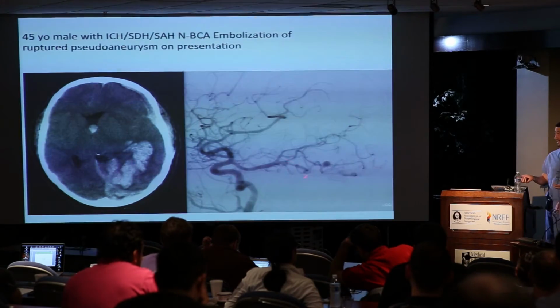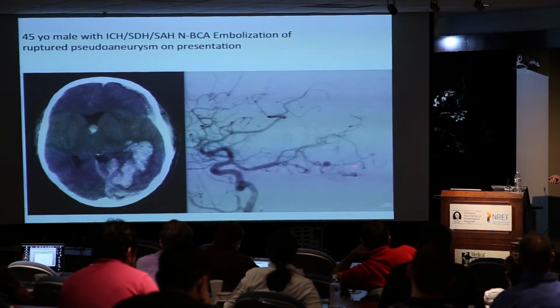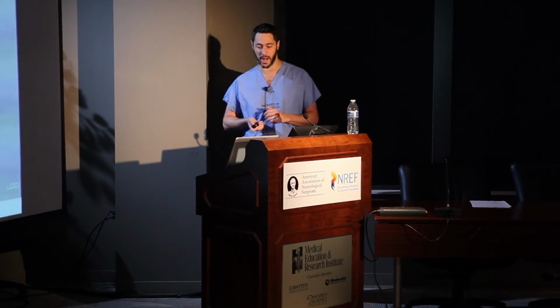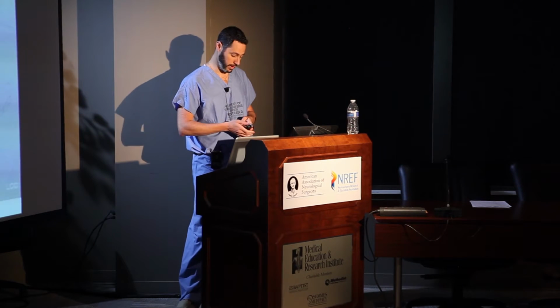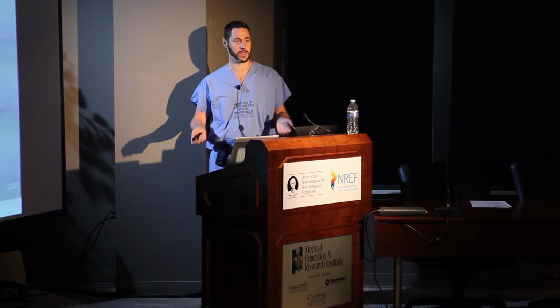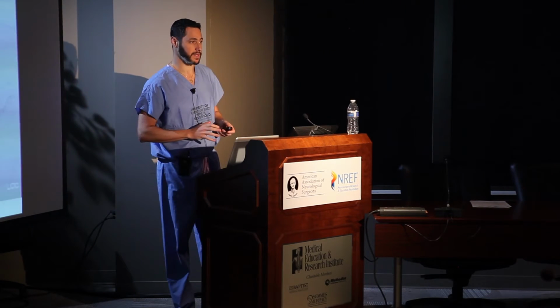Actually, he had a CTA, so we can see this on the CTA. And you can see that there's probably some, and I think this is a good example of compressed nidus, too. There's a lot of mass effect. You see this early vein, but you don't see a big compact nidus, but I wouldn't be surprised if it's there. But that's not what's important right now. In my mind, this is a very high-risk architectural feature, the one that needs to be dealt with immediately. Obviously, we're dealing with this ICP crisis at the same time, and we have a plan to fix this and get our butts to the OR, okay, and decompress it.